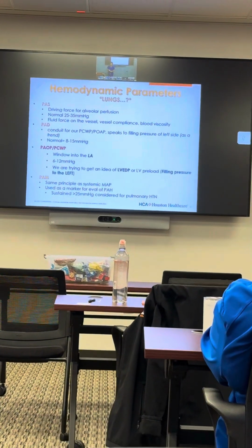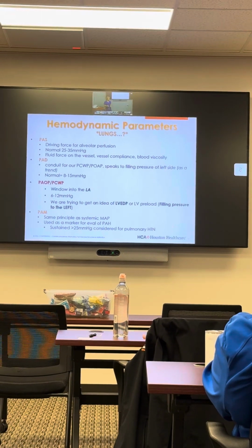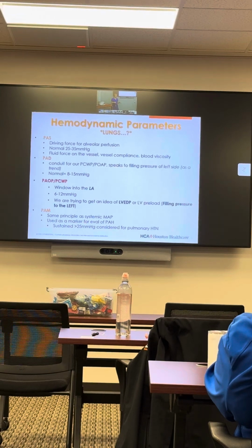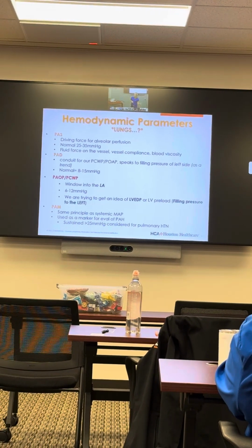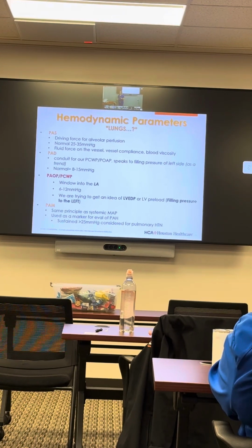Drug cause, type 1, group 1, very rare. So no one invented the PA catheter for that, all right? The PA catheter was invented so that we could more accurately assess the filling pressure to the left side.